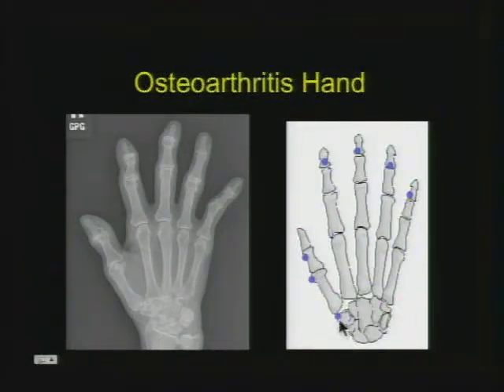So with these little diagrams, we have the involvement of certain arthropathies in the hand. We think mostly of OA of the DIPs and the thumb and the first carpometacarpal joint. You can see PIP as well, but usually it doesn't go to the wrist. It doesn't go to the MCPs. I think that's a very helpful finding.